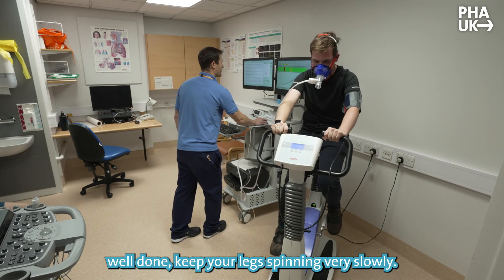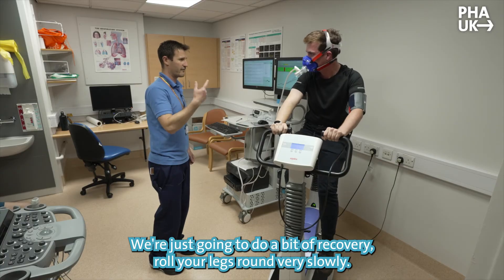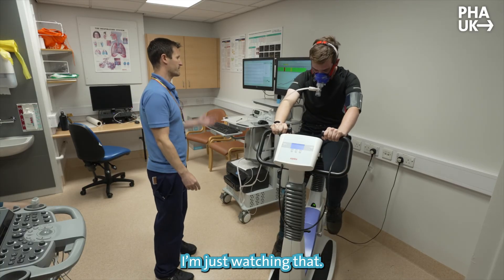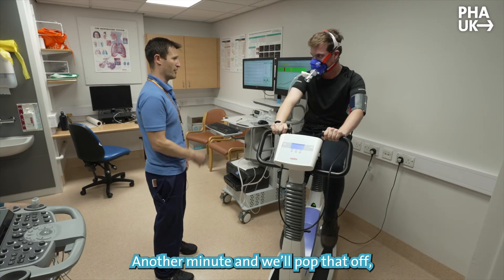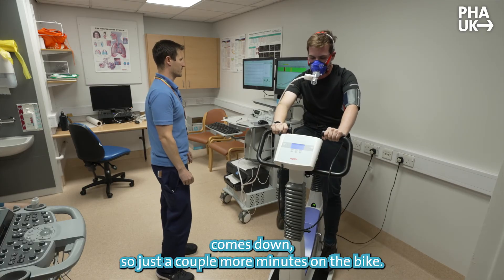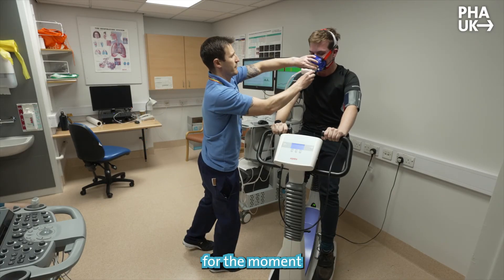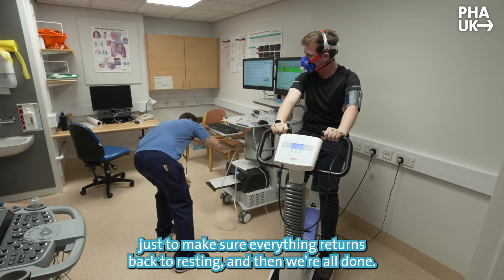Okay, well done. Keep your legs spinning very slowly — I've dropped the weight off, just roll them round. We're just going to do a bit of recovery. Roll your legs round very slowly, no need to worry about the pace. Just watch everything settle back down. We're going to watch your breathing for another minute, so I'll leave the mask on and then pop it off. Then we'll make sure your blood pressure and heart rate come down — just a couple more minutes on the bike. Bring it around to a stop now. I'm going to pop the mask off, but I'll leave you on the bike for the moment so we can keep recording your blood pressure and heart rate until everything returns to resting.